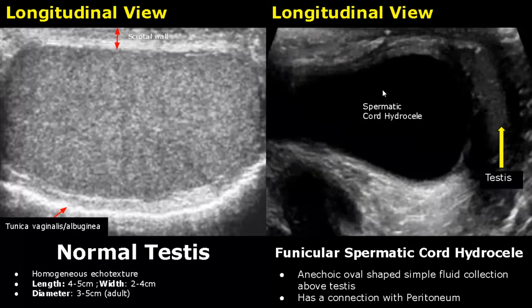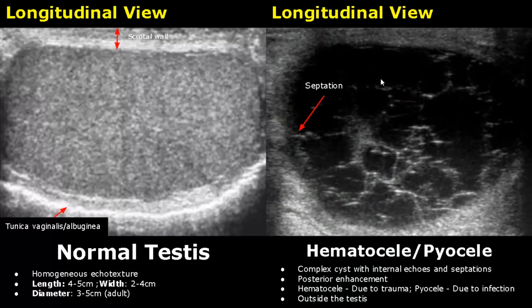The funicular spermatic cord hydrocele will communicate with the peritoneum — as you can see, it is open from here so there is a connection with the peritoneum. It is the second type of spermatic cord hydrocele. A hematocele and a pyocele have similar appearances: they consist of a complex cyst outside the testes with internal echoes and septations, and posterior enhancement will be present. A hematocele contains blood as a result of trauma, and a pyocele consists of pus and is due to infection.